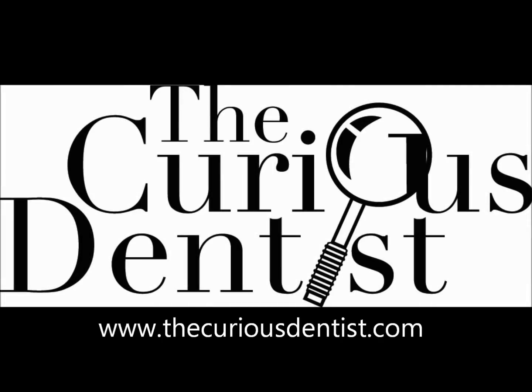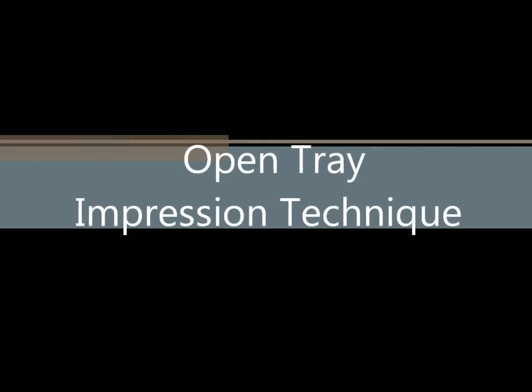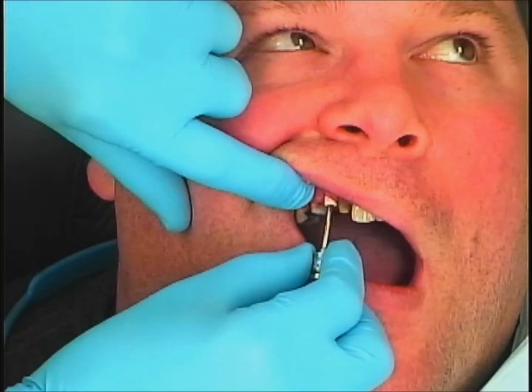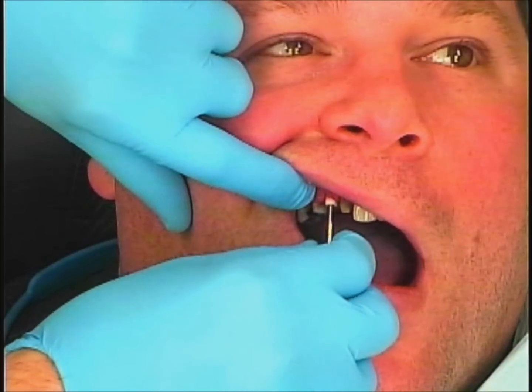Hello, Chris Salerno here with The Curious Dentist, and I'd like to talk to you about my open tray impression technique for impressioning dental implants. I'm going to be showcasing the NEOS system, which is one of my favorite systems out there.